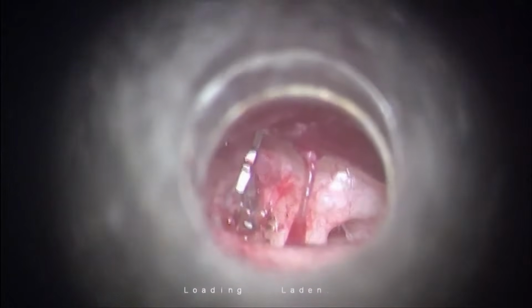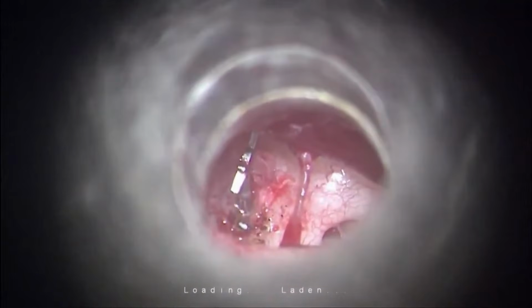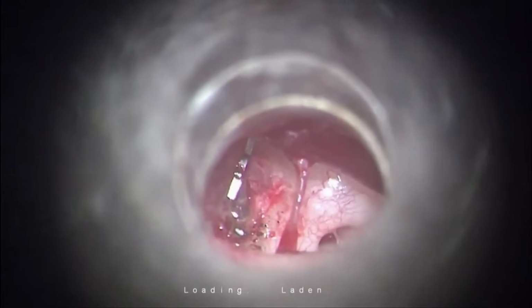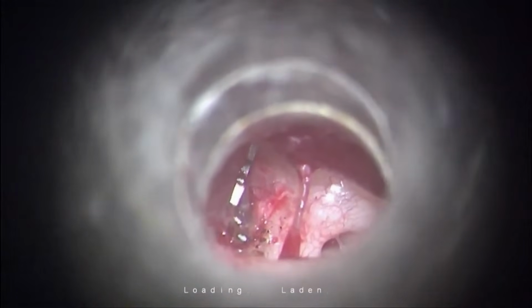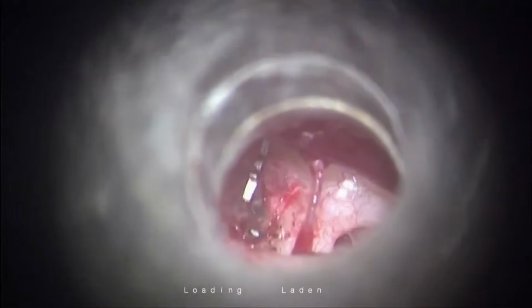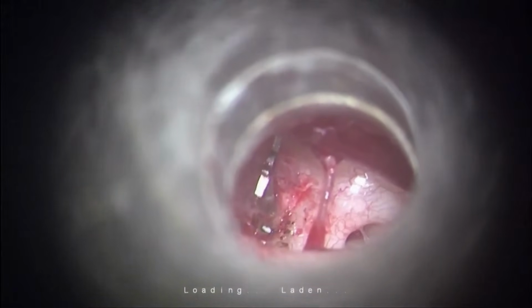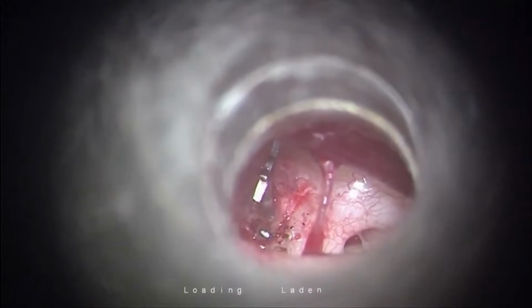Suppose I had been facing the same situation as Ashish, I would do the same thing. I would never use the laser on the thick footplate. I would use a drill to flush the blue footplate, and then I would use the laser to make a fenestra and use this piston. That would be the only change in the technique.